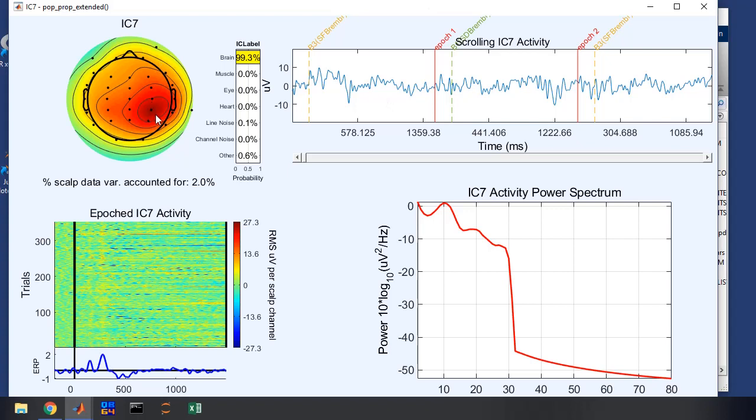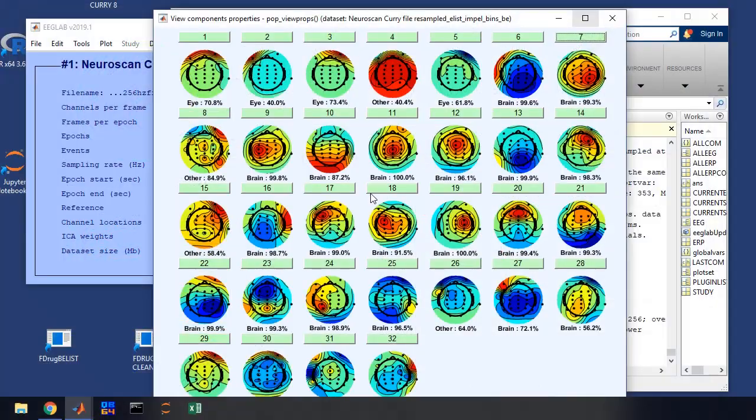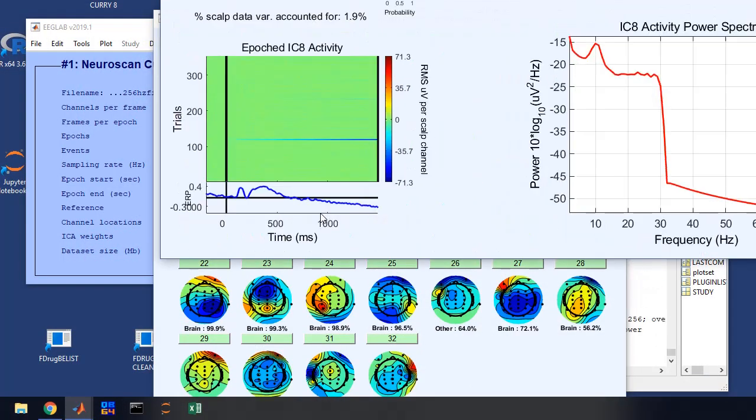Again, the plots. And you can see where it's coming from. It's not coming from the ocular channels, for example, or the eye channels. So let's look at eight for other. And here's a good example of some data, some kind of artifact that happened only in a brief, small segment of trials.